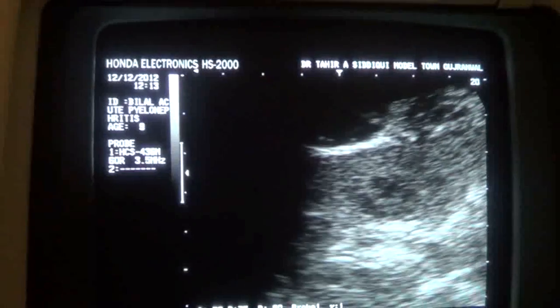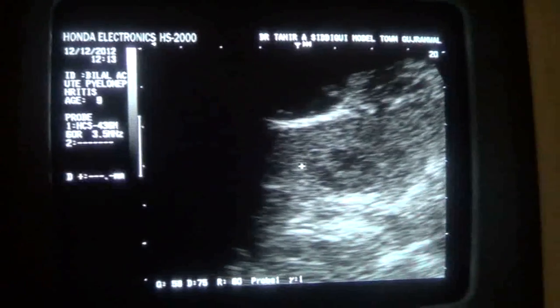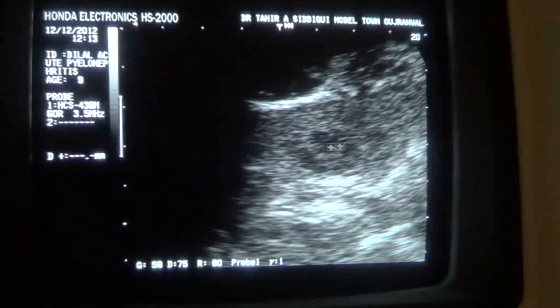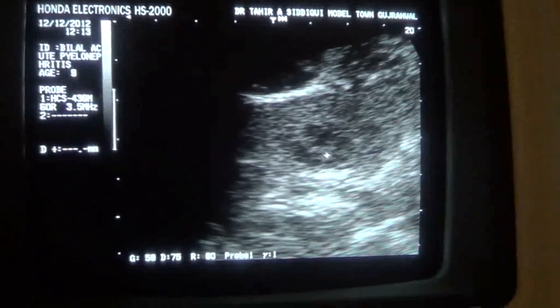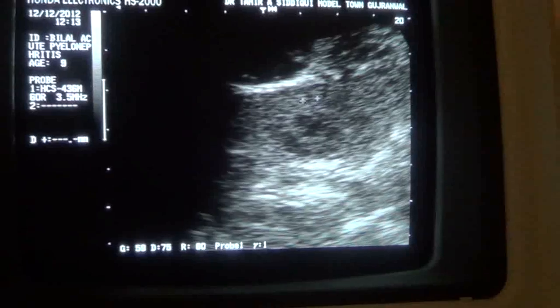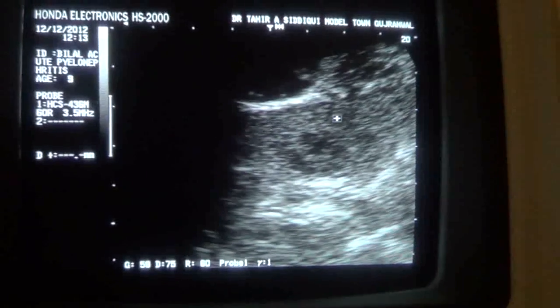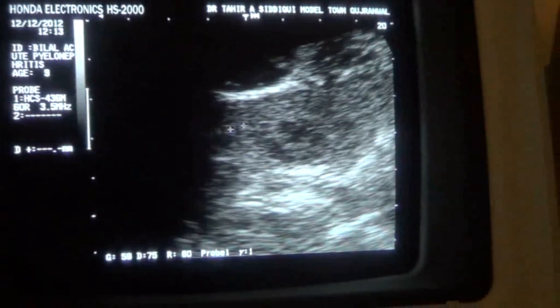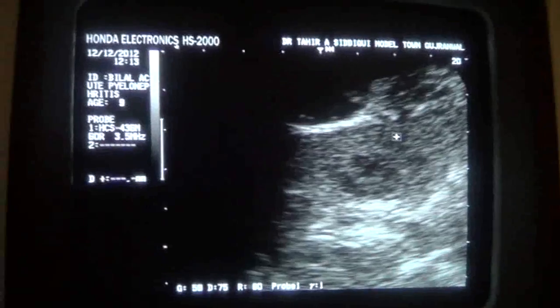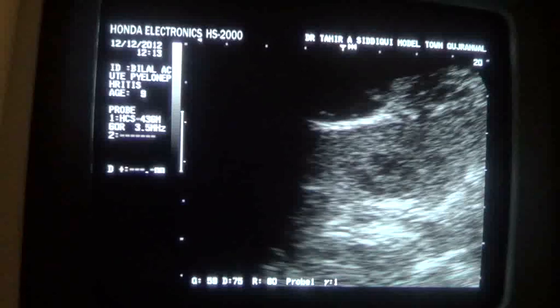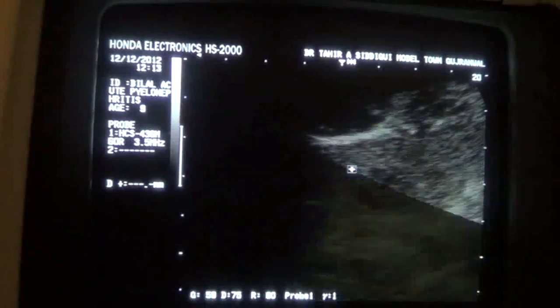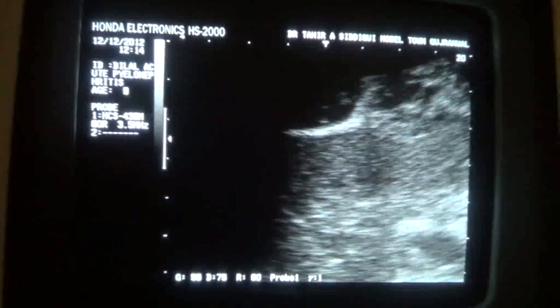Now this is one of the pyramids — see how much it is filled with echoes. This is the cortex; see its echo brightness is significantly more as compared to normal.